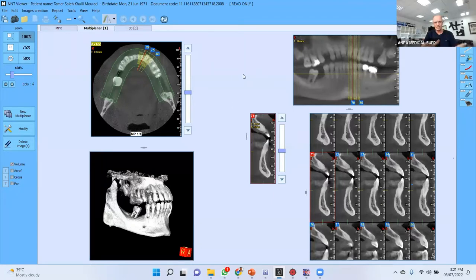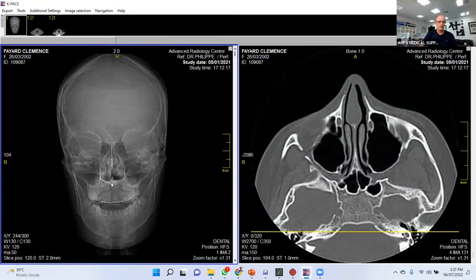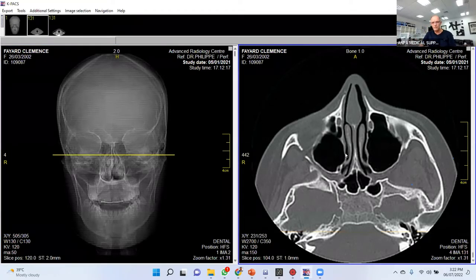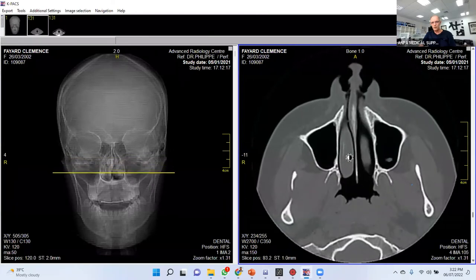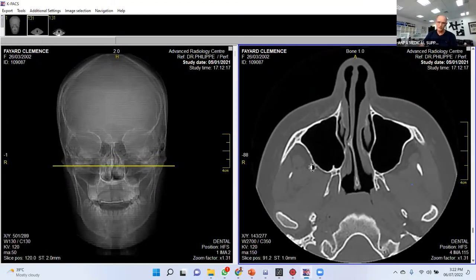A third example from a spiral CT program: the image is fixed, you cannot freely rotate it — only by 30, 45, or 90 degrees by default. You can travel up and down from the nose through axial slices and know your level, but this is far from sufficient for what we need. This is not what we are looking for.